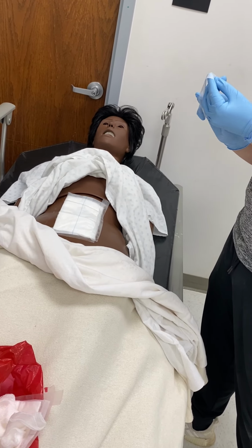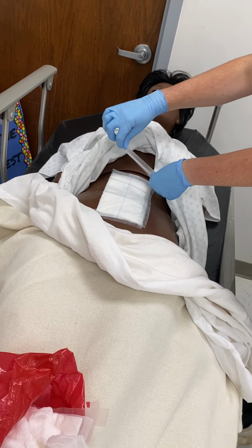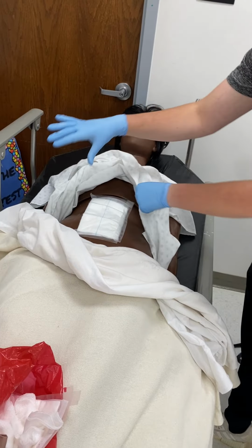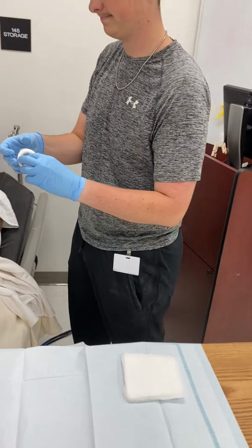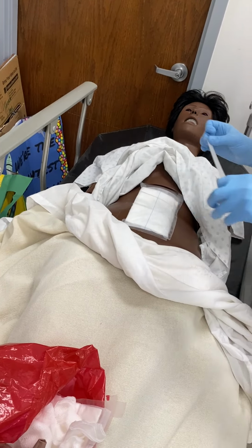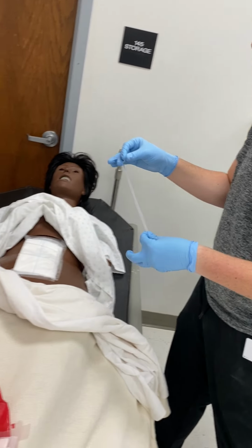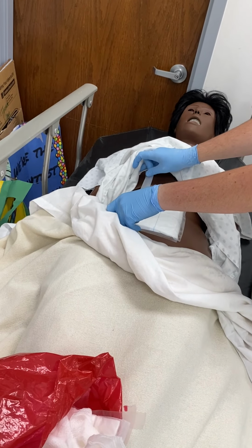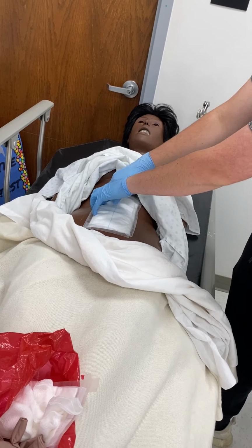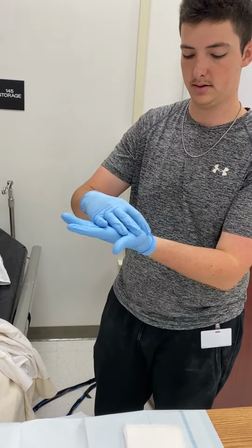Fold it over on me. Go back to that with the second part of our tape. Alrighty, now all four sides have been taped down.